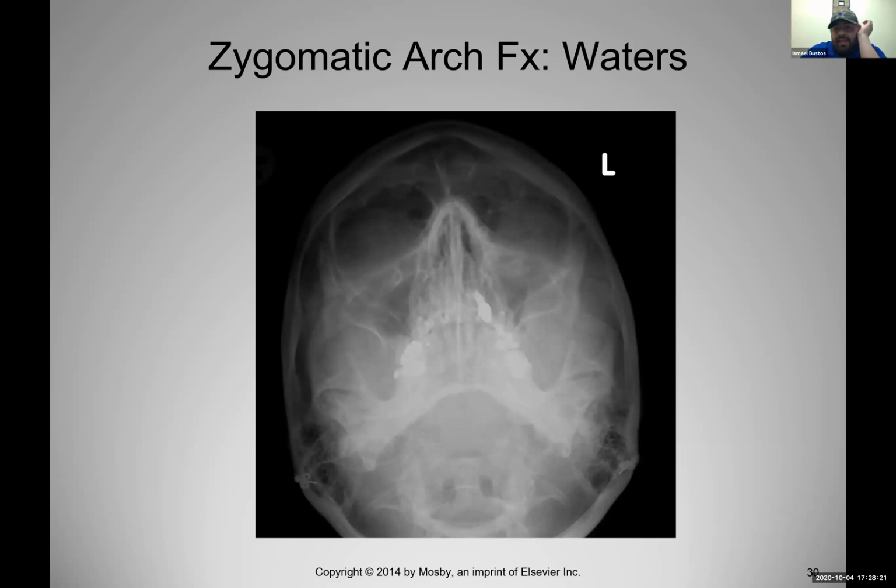So if you said that the fracture of the arch is on the right side, you are wrong, right? It's on the left side, right there. You see how it comes this way and then sharply goes down? You want it to be round like this one here. Okay, so I'm going to take this off so you can see it, but yeah, the fracture is definitely right there on the left side.